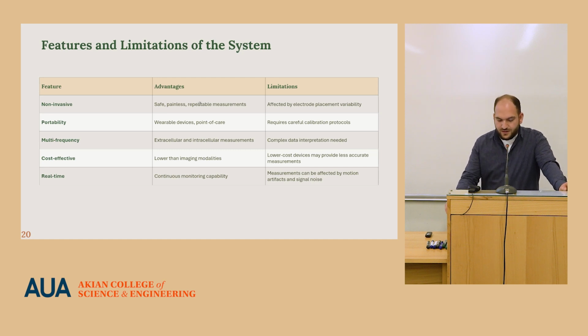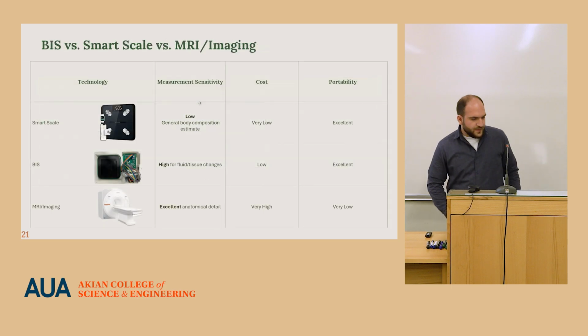As a limitation, it requires careful calibration protocols, and it needs complex data interpretation. Also, a badly connected electrode can affect the results unexpectedly. So those are the features and the limitations.